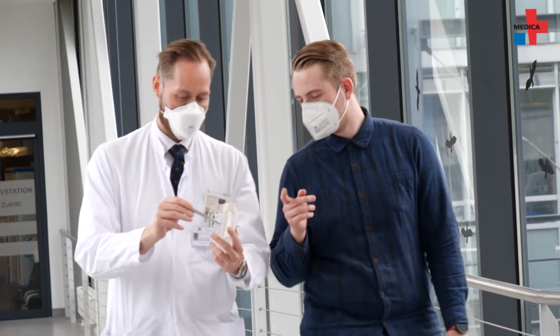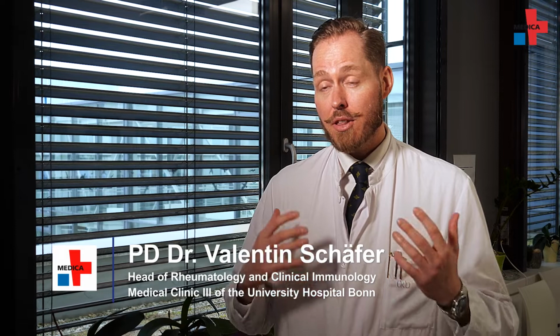at an early stage. This concept is very special as our working group is the first to enable 3D printing of ultrasound phantoms. And these ultrasound phantoms can be used for early diagnosis of arthritis, for example. We are able to print every joint of the body, which is especially important in arthritic diseases like psoriatic arthritis or rheumatoid arthritis.